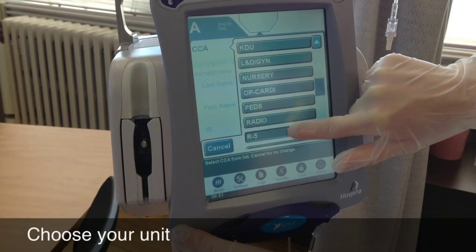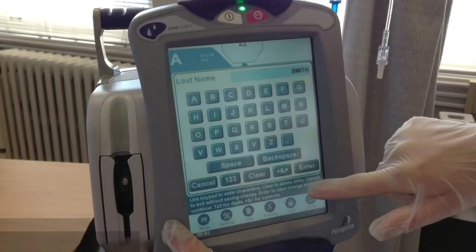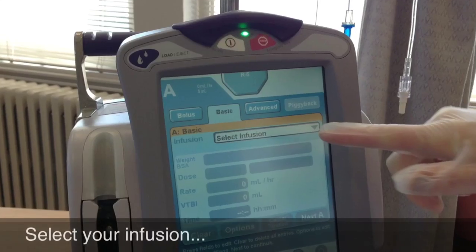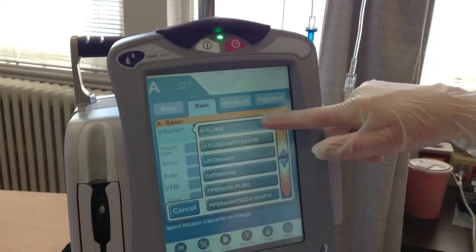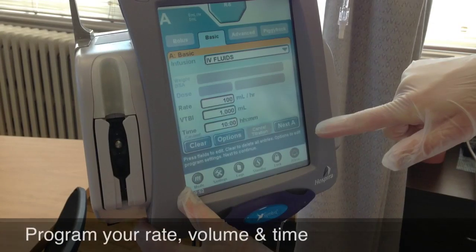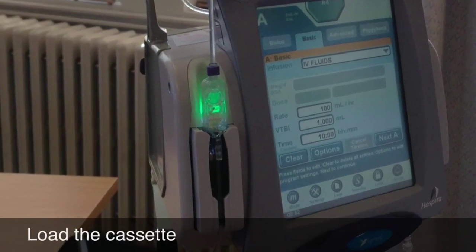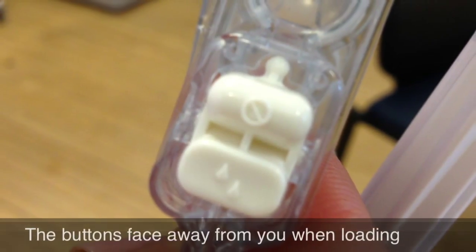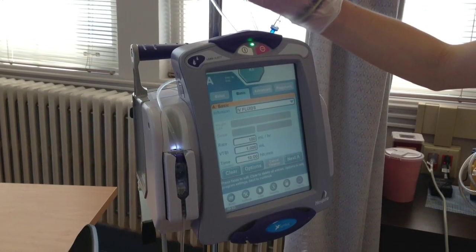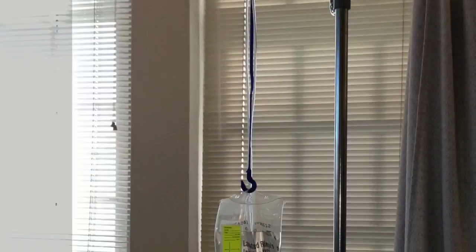Programming the pump is very simple — it gives you step-by-step directions. Choose your unit first. If you have to put in a caregiver ID number, it'll be your instructor's or your nurse's. If this pump hasn't been used for your patient before, you'll have to enter patient information. Then select your infusion type — in this scenario we're using standard IV fluids of normal saline. Enter your rate, volume to be infused, and time as ordered. Then load the cassette into the pump with the buttons on the cassette facing away from you.